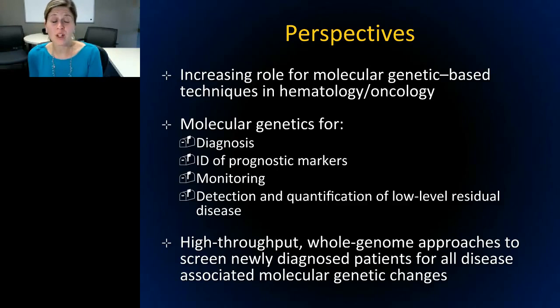It depends upon what assay the laboratory happens to be using and what instrumentation the laboratory happens to have on hand, or if it's in a research setting, you could be doing any number of these different assays. If it's a fusion transcript, FISH is very, very useful if you know what that sequence is, because you have to have a probe for that known transcript.